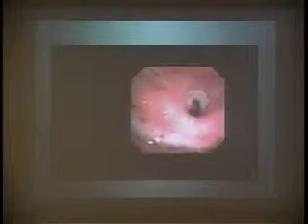With the epiglottis in near view, the tip is positioned to spray lidocaine via the scope's suction channel. Appropriate time is given for its action before advancing. Secretions and excess lidocaine may be removed using the scope's suction channel. The fiber optic scope enters the subglottis. The trachea and carina lie ahead. The tip of the scope is advanced, staying in the middle of the tracheal lumen and avoiding contact with the mucosa.